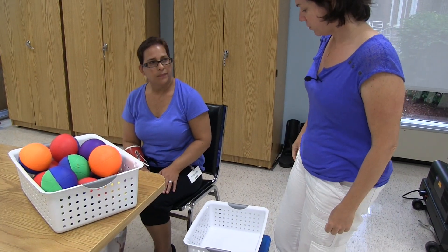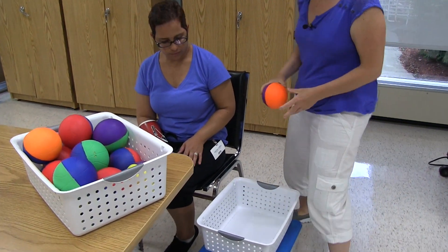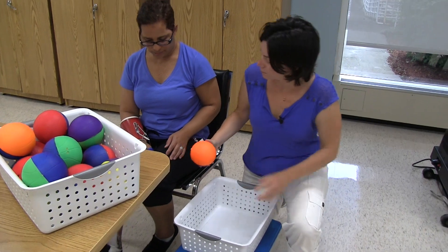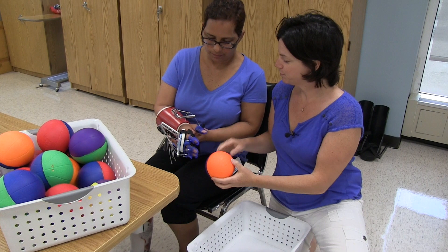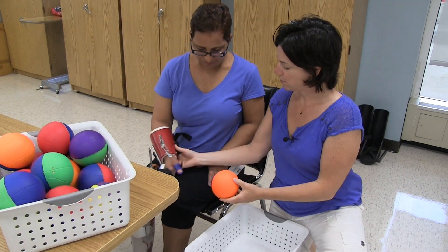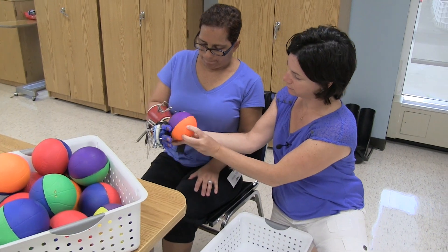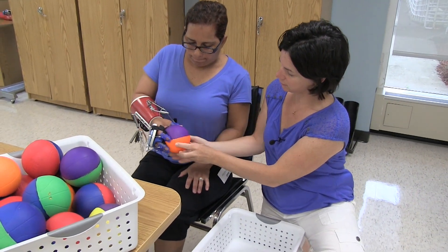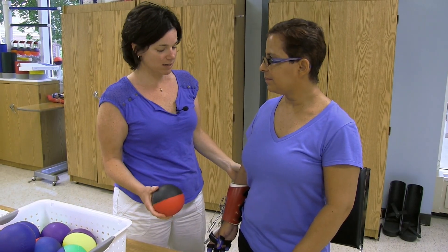So now instead of just dropping it, we're going to try to really aim for putting it into the bin. Get that hand out of there. Ready? And squeeze it. Good. There you go. Good, good.